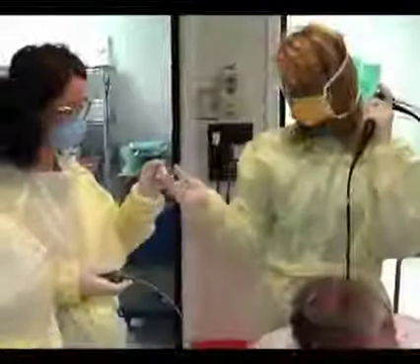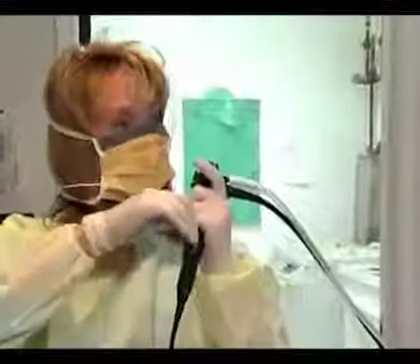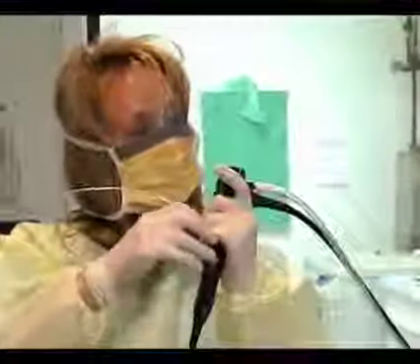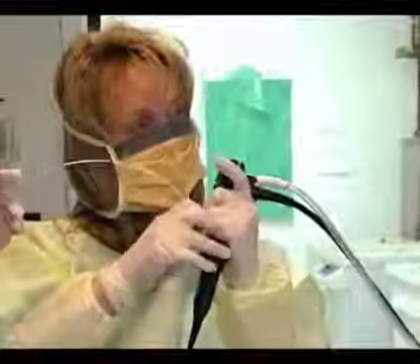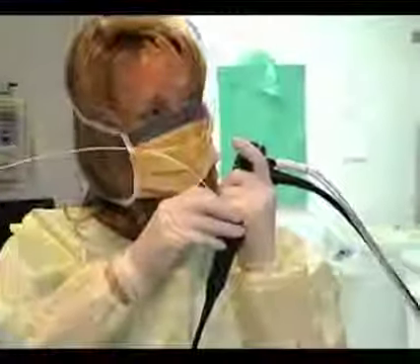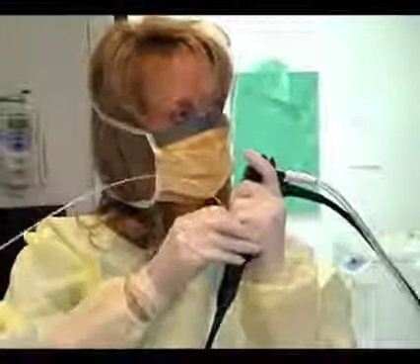So I'm just doing a completion inspection of the entire bronchial tree to make sure there's no occult endobronchial lesions before we go back to our TBNA. So I'm just going to place this into the working channel next. And because this patient's adenopathy lends itself more to the left main carina, just below the bifurcation, I will approach that aspect of the subcarina from the left main stem.